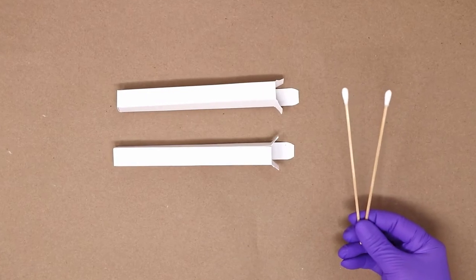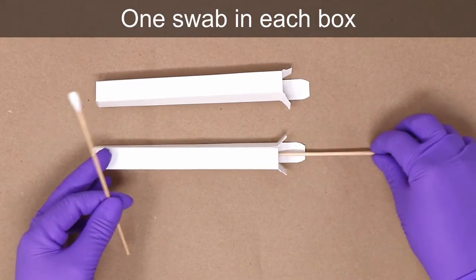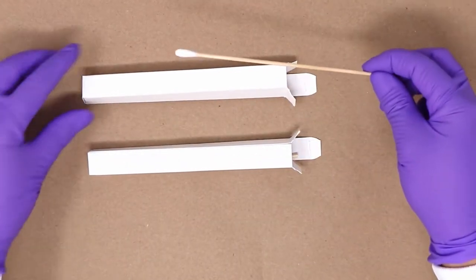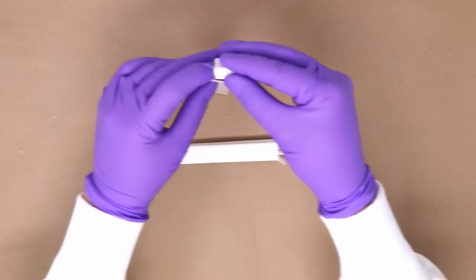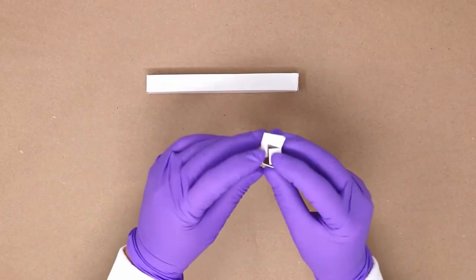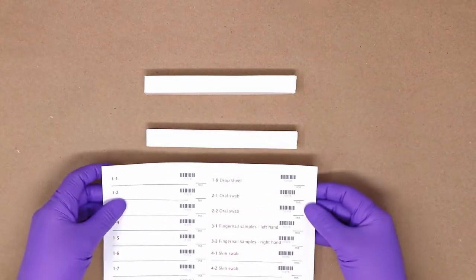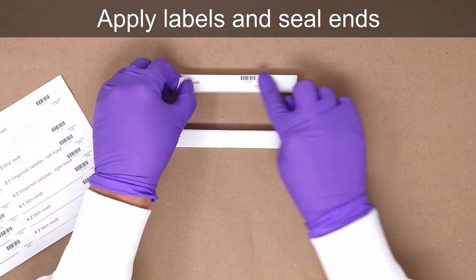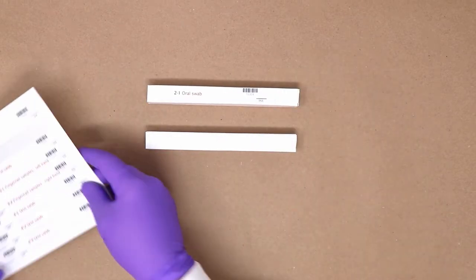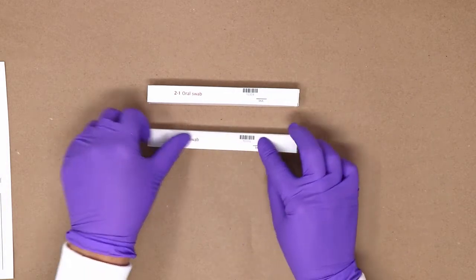Once the swabs have been collected, they should be placed into separate swab boxes, 1 swab per box. The swab boxes will allow the swabs to dry over time. The ends of the swab boxes should be closed to prevent the swabs from falling out before continuing with the next step. And labels should also be applied at this time to ensure the continuity of this evidence that's been collected. In this case, 2-1 oral swab and 2-2 oral swab. Initials should also be added to these labels.